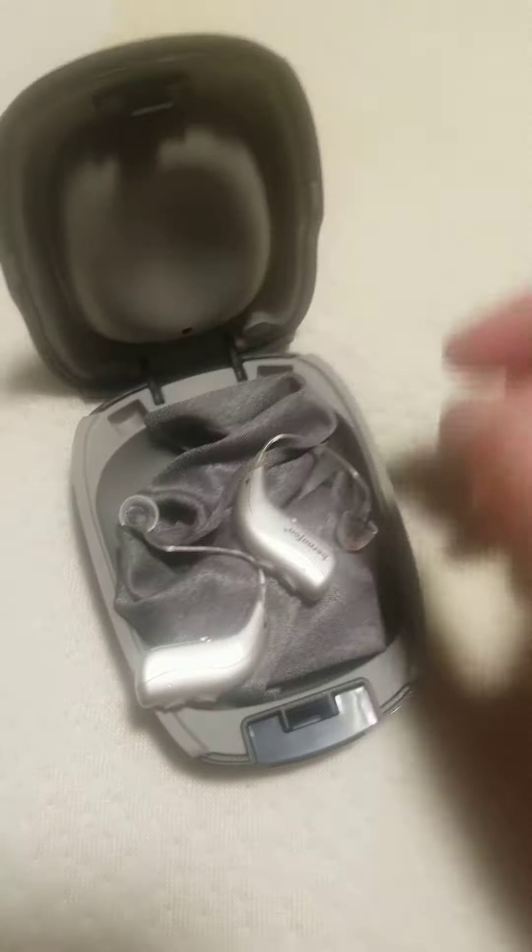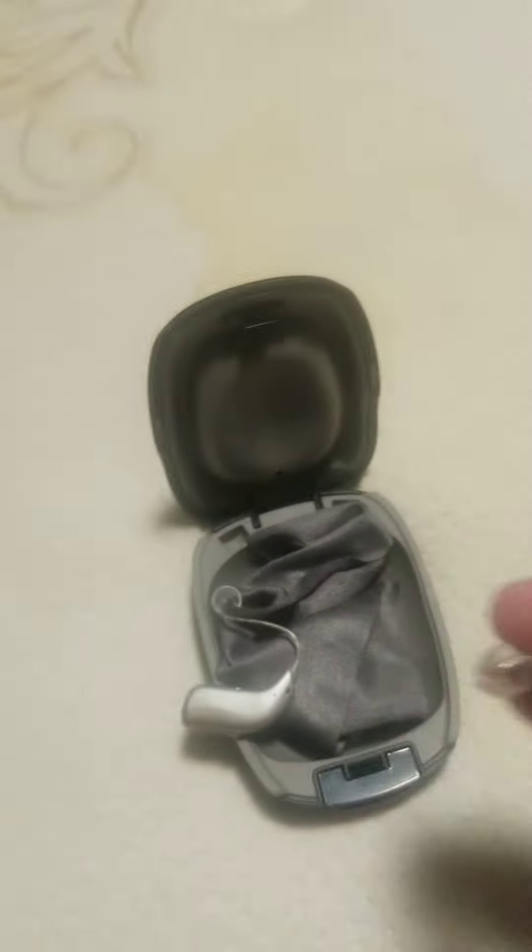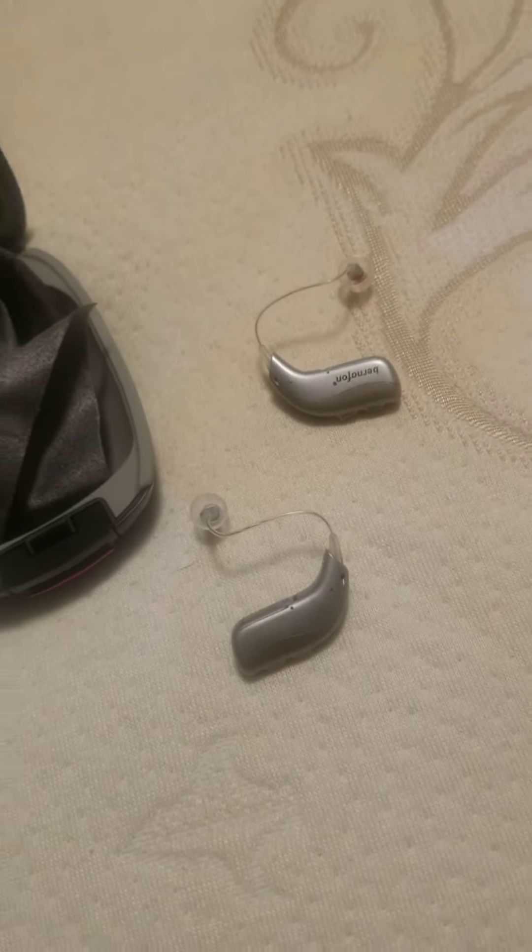This is a rechargeable hearing aid. The red one is for the right ear, and the blue one is for the left ear. It's a rechargeable hearing aid and it's really good.